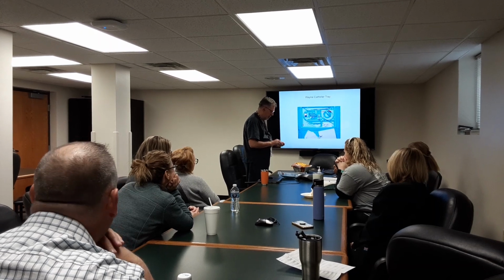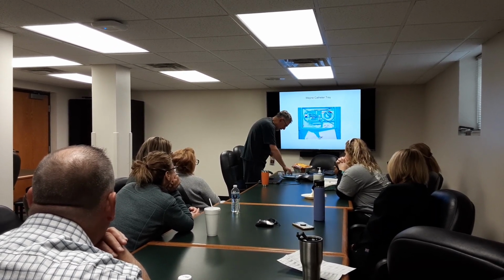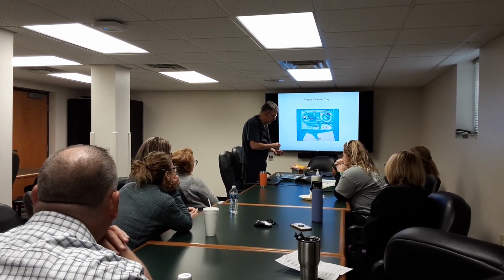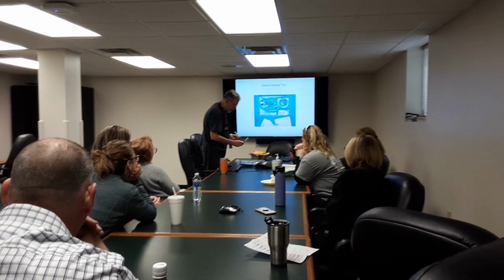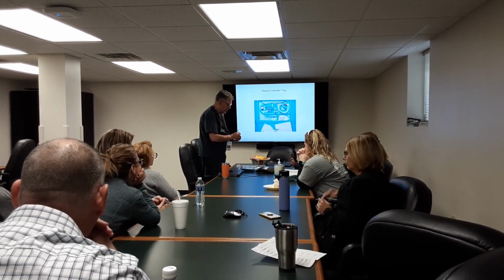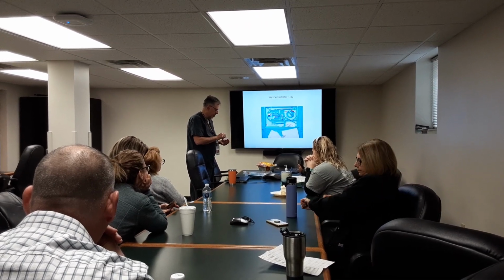So with this, I would go in there and typically I'll use a 5, but we've got a 3 or a 10. You could use the same one for the superficial and then also for the deep. I think in this kit, this is what they're using for superficial, and this is what they're using for deep. This is a little bit more bulky, so not quite as nice, but the 5 cc is what I typically use.